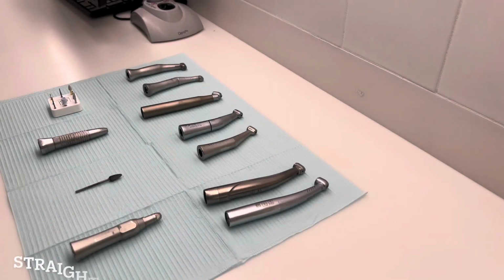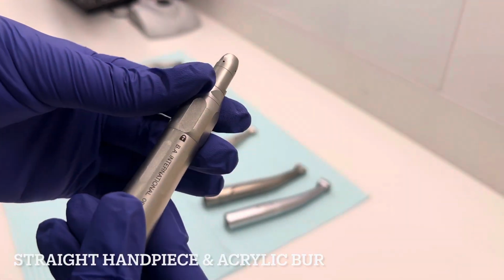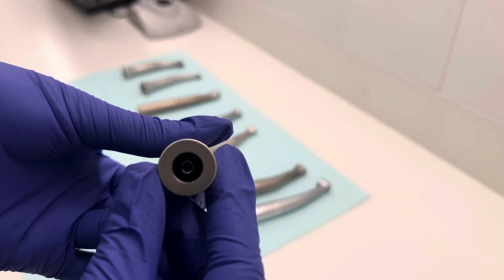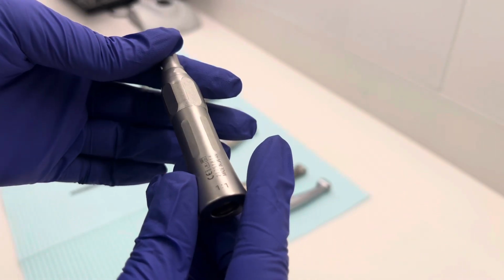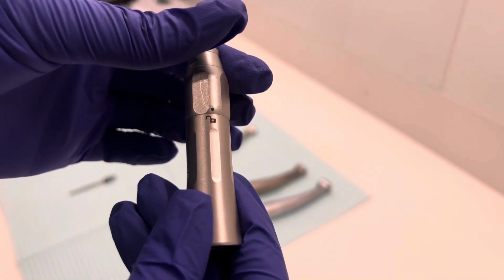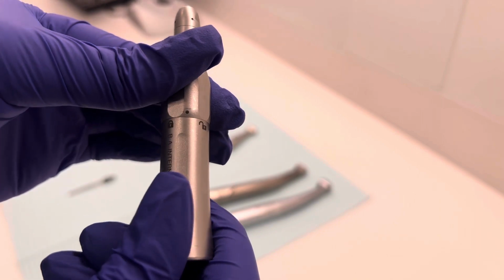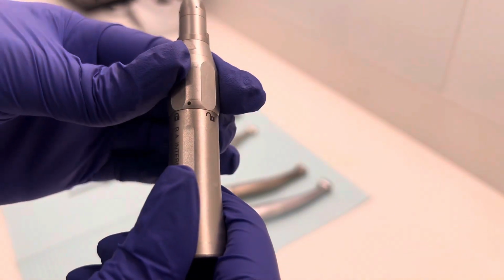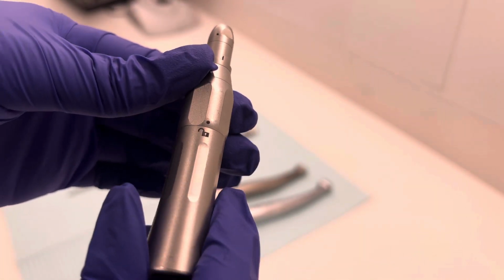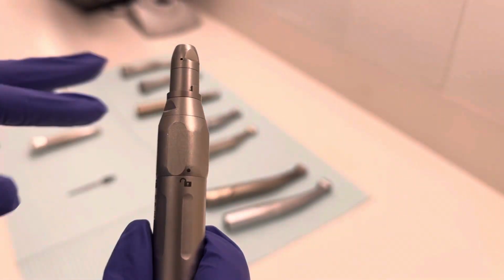Okay, so starting with the very first one, we'll start with the straight hand piece. This is usually used for making adjustments of night guards, among many other things. As you can see, it's short, it's almost as long as a finger, and it has the lock and open dials, so you just twist it accordingly. Usually you're closing when you're trying to put a burr inside. I'm going to demonstrate that. One second. I'm just showing you how it locks and opens before you put in the burr.